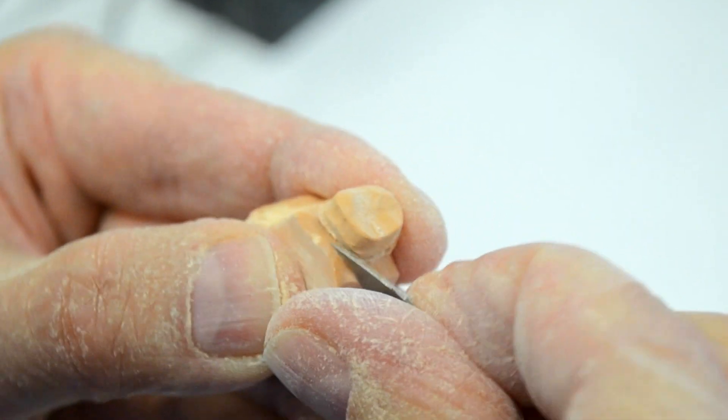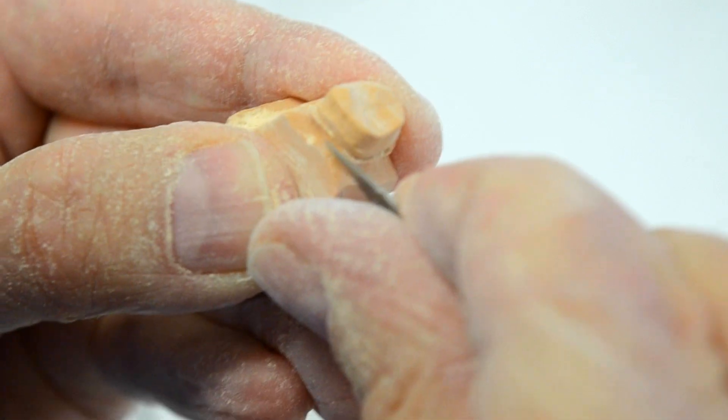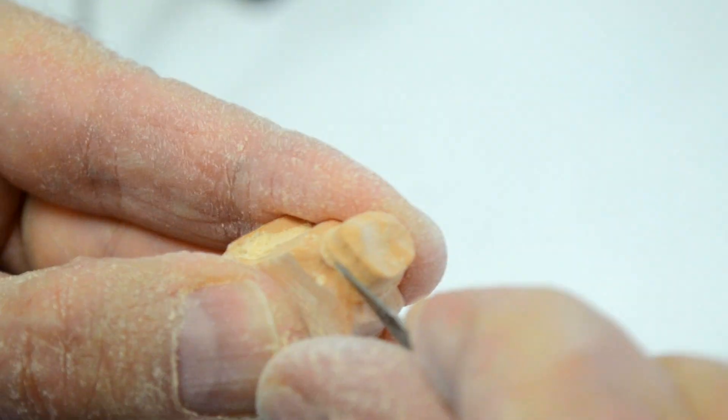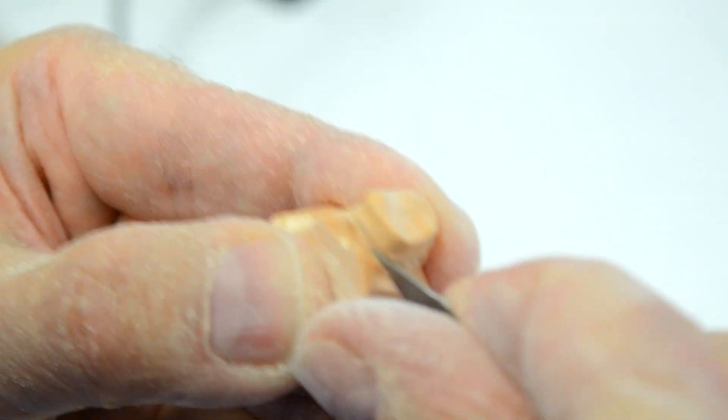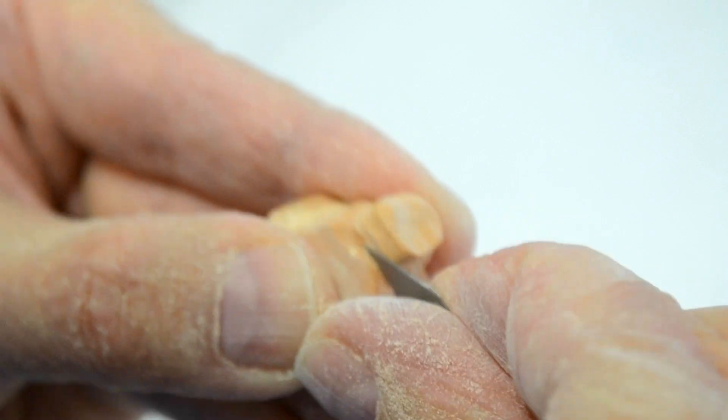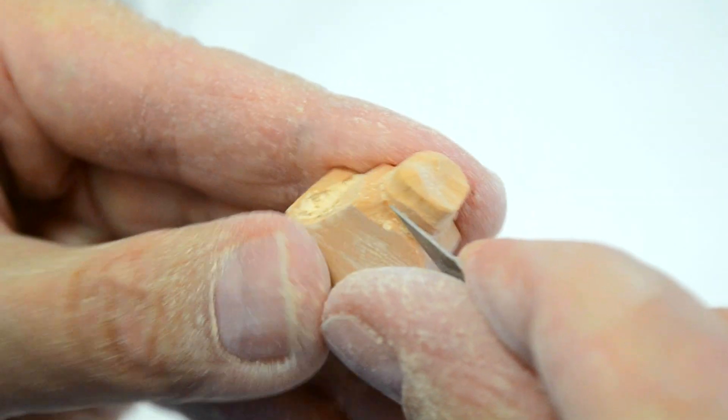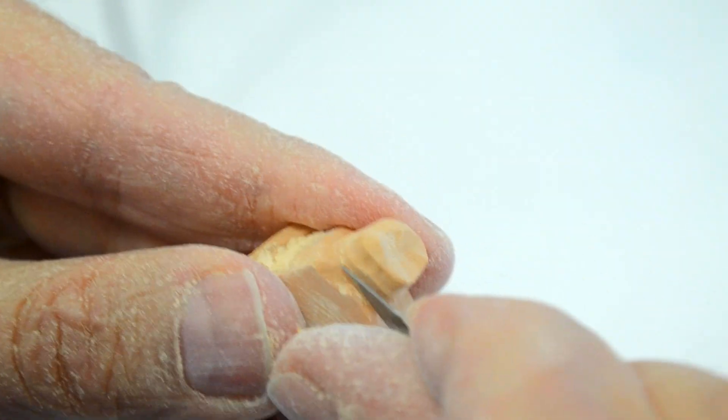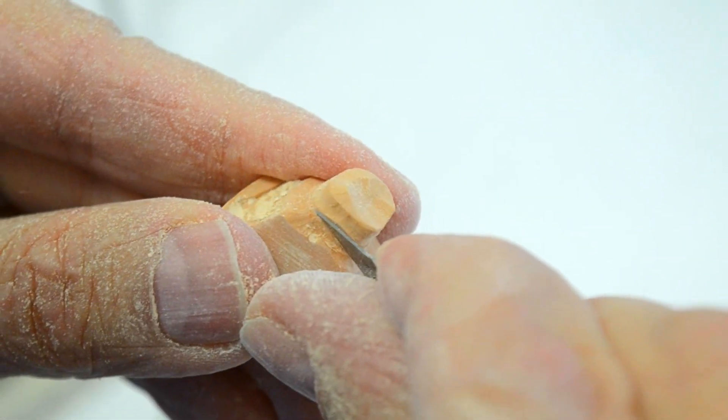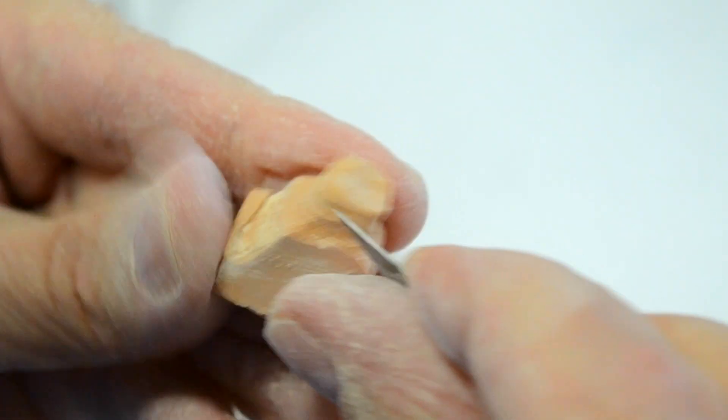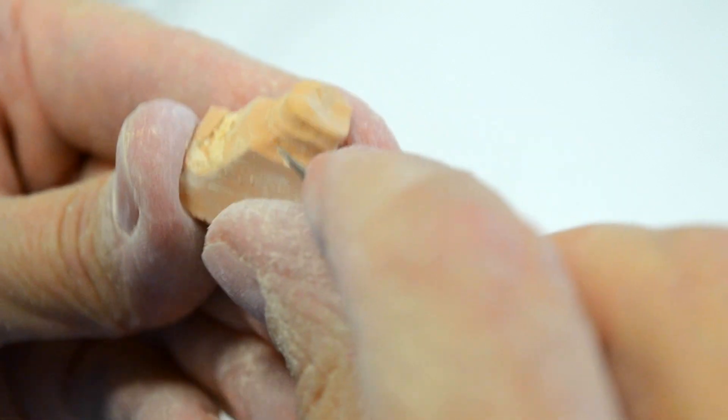Now when removing the stone, light pressure is exerted in an apical direction, just as I'm doing right now. The idea is to expose at least anywhere from three to five millimeters of finish line in your tooth preparation or external bevel if we're talking about inlays and onlays.